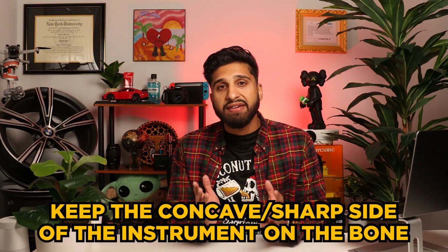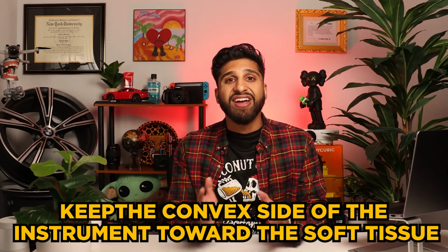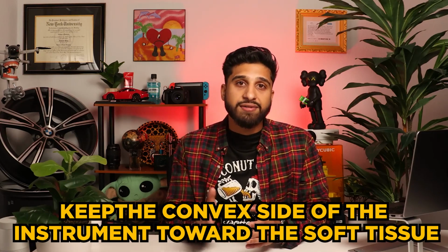She goes on to say, while reflecting the flap, keep the concave and sharp side of the instrument on the bone, while keeping the convex side of the instrument towards the soft tissue. Doing this slowly and gently minimizes the risk of tearing the flap, which will make suturing easier since you won't have tears. Minimizing the tears to the flap will also help speed the healing process and make your healing more predictable. Then she gives me feedback on how I pack the graft into the site.